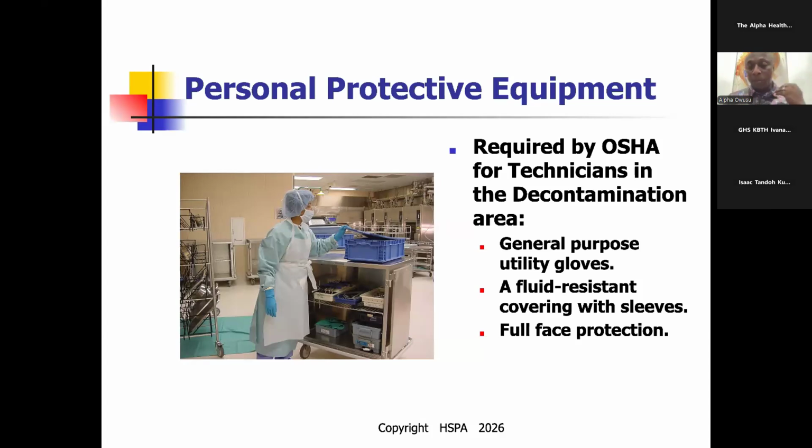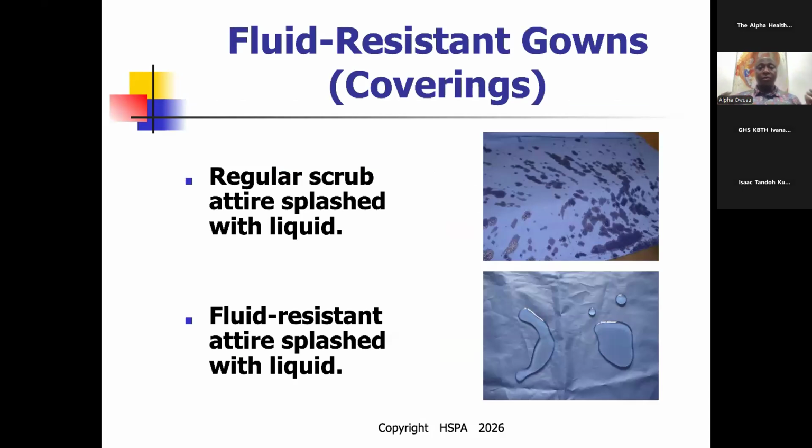So, my wonderful facilities, these facilities that we are going to visit, it is very important for us to get these PPEs to protect our patients and staff members. Right, shoe covers. And then resistance, so it should not soak. The scrubs should not soak. When liquid splashes, it has to be like the second one. It should not soak it. By doing all these things, you are preventing infection.